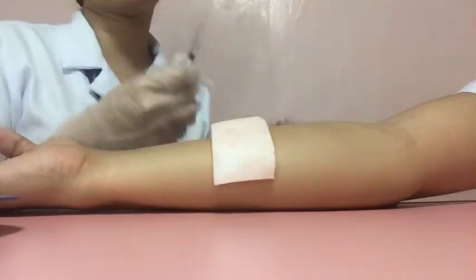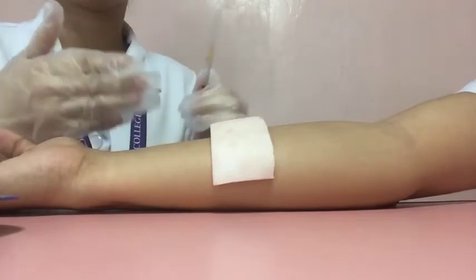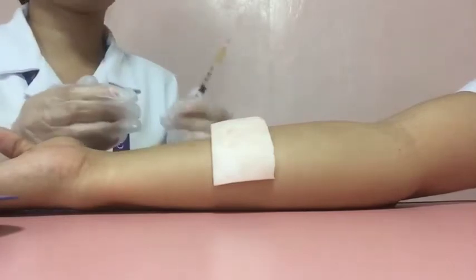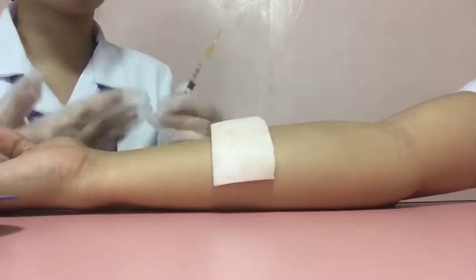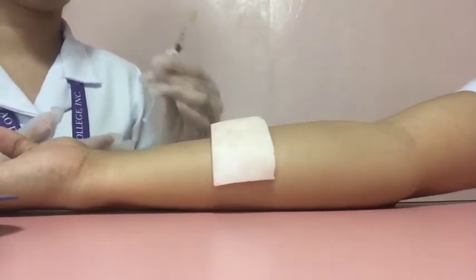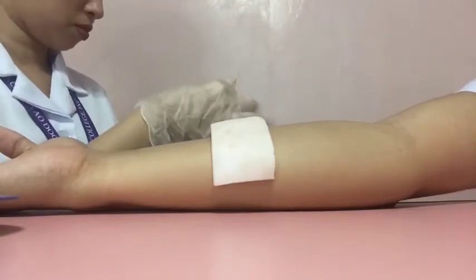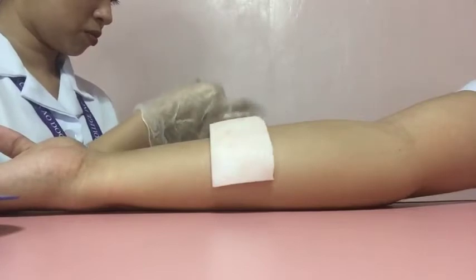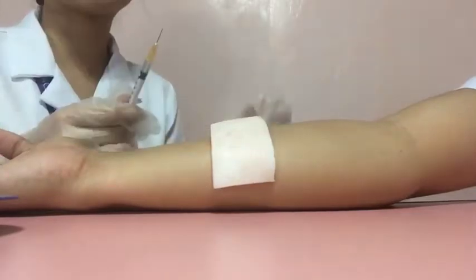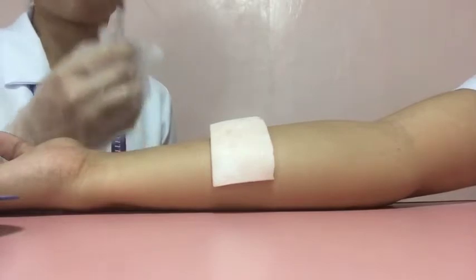So now prepare the syringe for injection. So remove the needle cap while waiting for the antiseptic to dry. Then expel any air bubbles from the syringe. So small bubbles that adhere to the plunger are of no consequence. Now grasp the syringe in your dominant hand close to the hub, holding it between the thumb and forefinger.